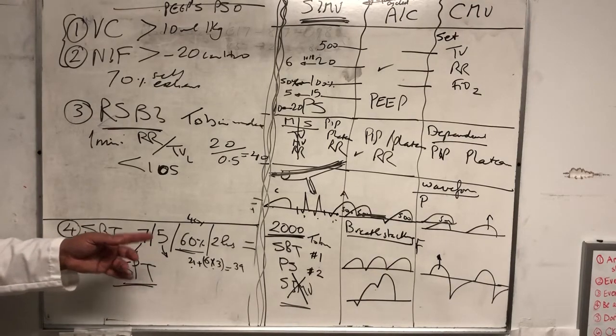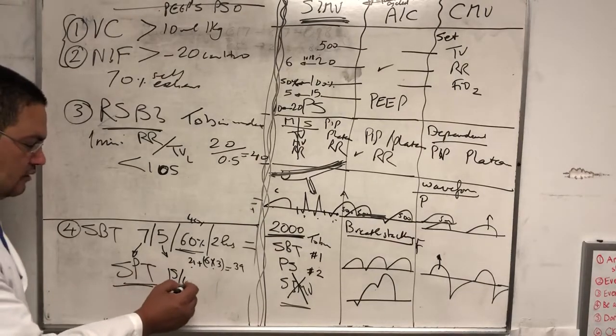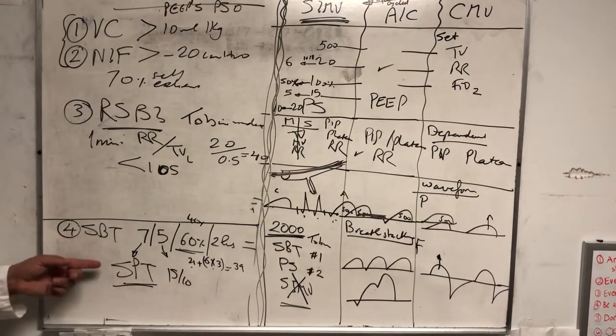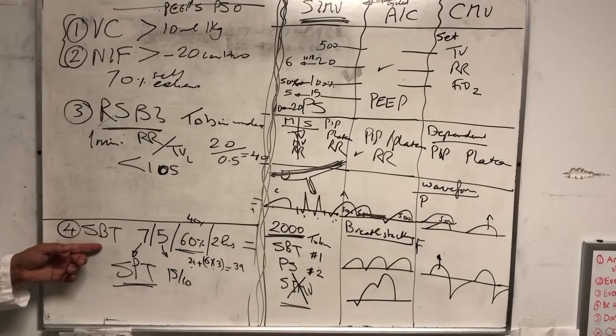So also, we don't want to deprive the patient that is breathing in the 40s from having their exercise every day. So put them on 15/10 or 12/5 or anything you want, and have him do 2 hours and go through it, and then put him back on the vent. That's all. So that's SPT. So the statement is there's no extubation after SPT, but there is a potential extubation after SBT.